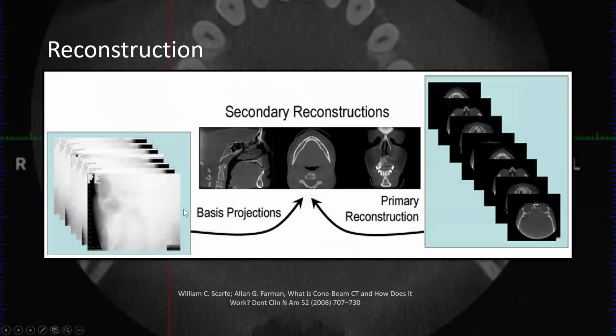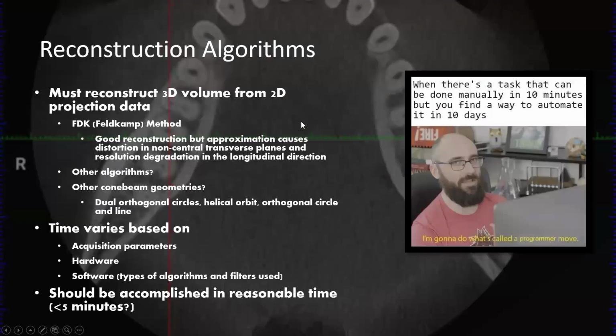This is showing the cone beam CT data as it's fed into there. You create the sinogram. And then this is showing a medical CT. It's automatically just taken more as axial slices. And then that's fed into some reconstruction algorithm. And that takes time. It's very computationally intense.